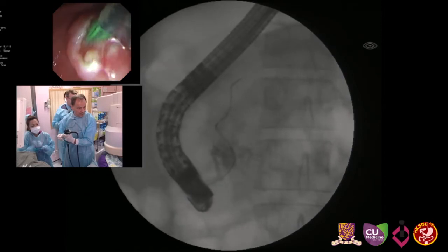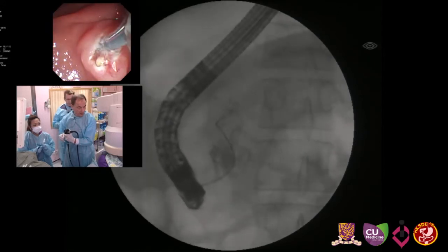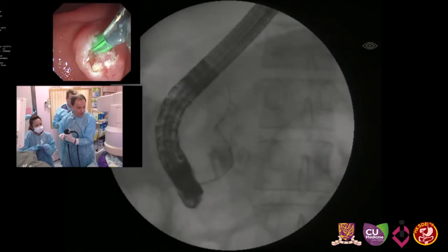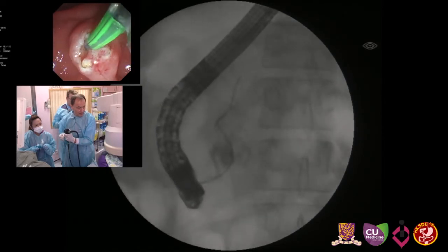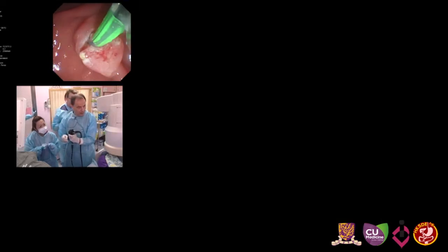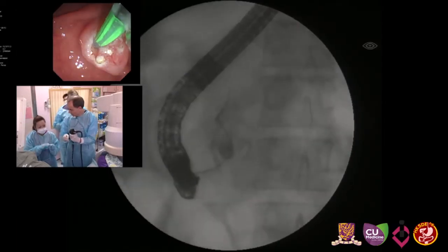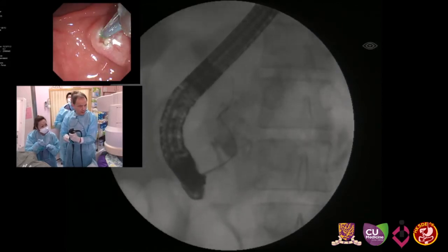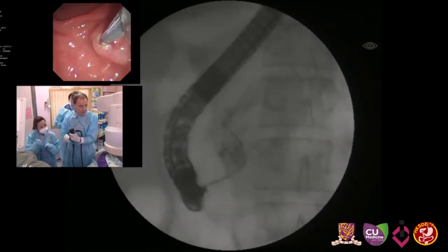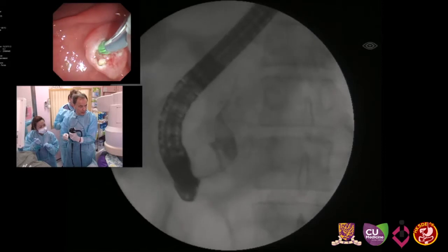Can you follow? Where is it? I pull it back a little bit to see. You feel resistance? No. It's definitely in the duct. Yeah, it should be in the duct. But do you inject? No, please inject. Okay. Do you think it's still in the pancreas? Yes, it has to be.